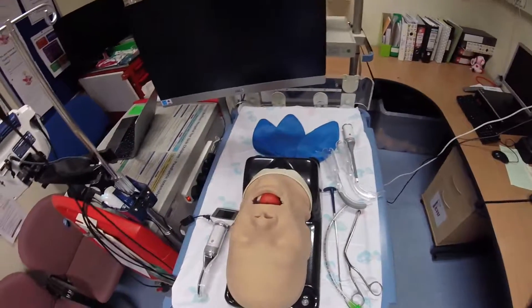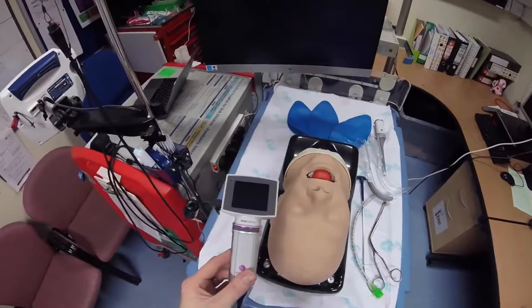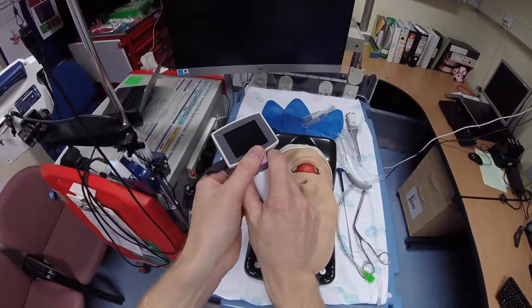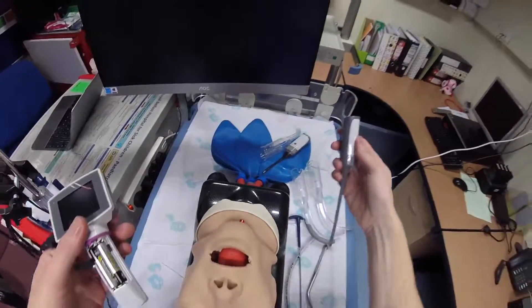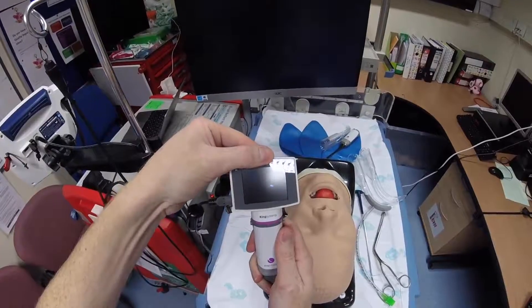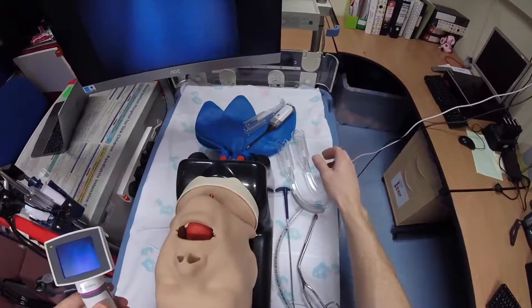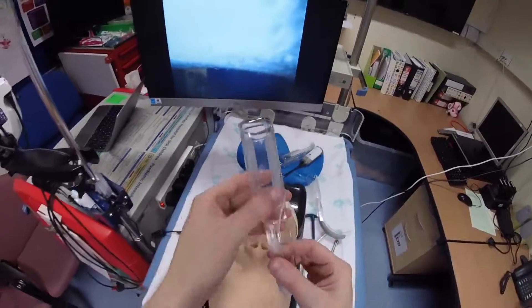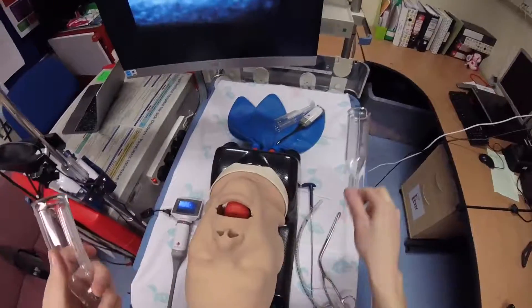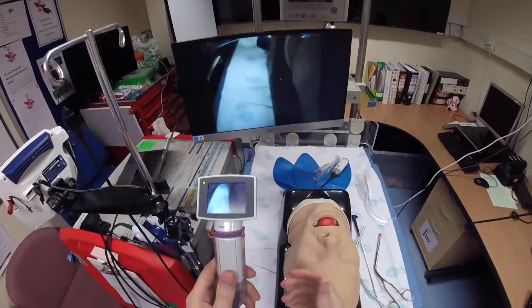Now switching to the adult difficult airway head. Changing over to the adult video adapter is fairly straightforward — we just remove the A-Blade, push this button down and the paediatric video adapter slides off. The adult adapter pushes on and it's ready to power up. The adult blade is designed to be used with size 3 A-Blades, which come in both un-channeled and channeled versions. Starting with the channeled version — it just slides in like this and you're ready to go.